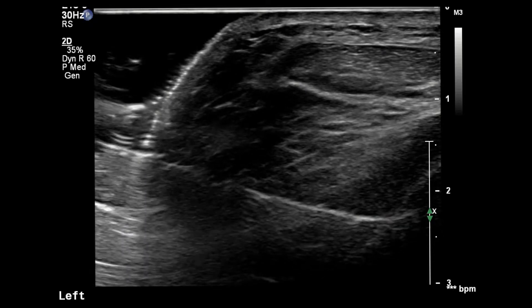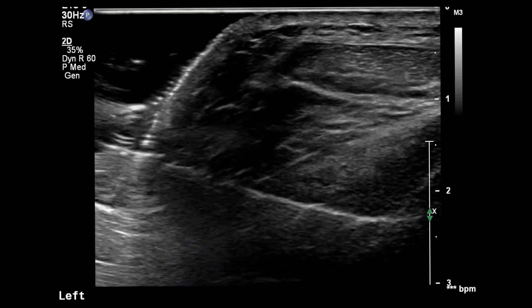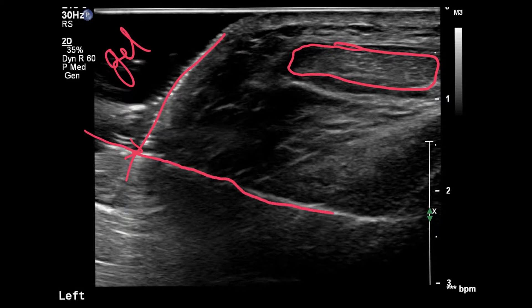Now there are a couple of other things to note aside from the actual injection. The patellar tendon is here. We're injecting the needle through the gel layer — this is a sterile gel — and we build up an offset, or a 'goo mountain' as I like to call it. We put the needle through that, and then the needle goes through the skin, through the fat pad, and into the joint itself.